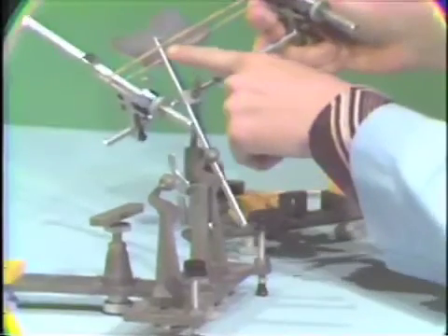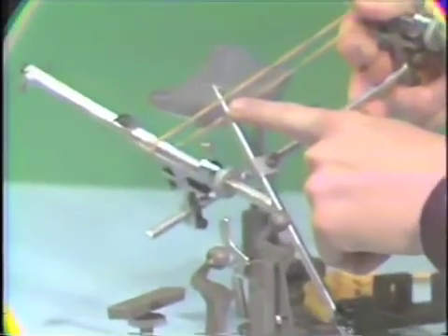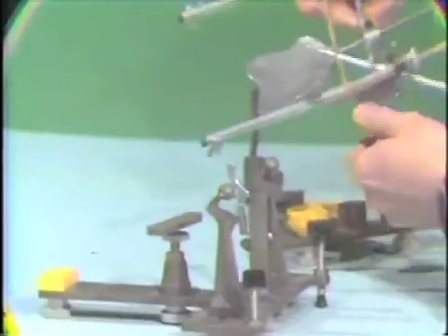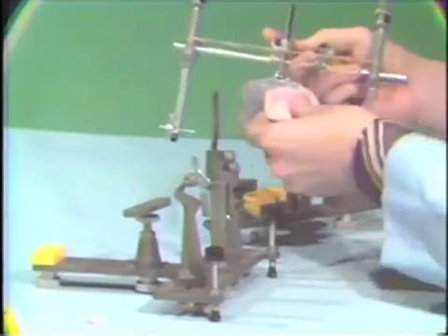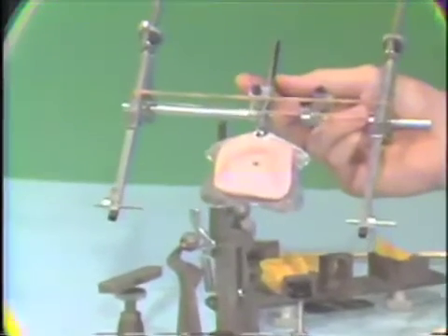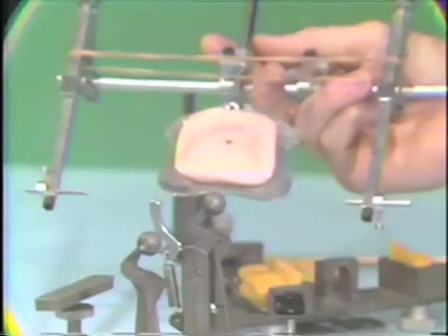We've also taken our third plane reference point, as you see here. This is a point just right of the nose. Okay, now the way we've hooked up our clutches, we've used our upper clutch in our original clutch former here, and we've used this for our face bow transfer. Now we're ready to take this apparatus to the articulator and begin our settings.